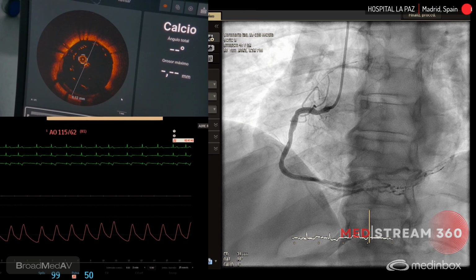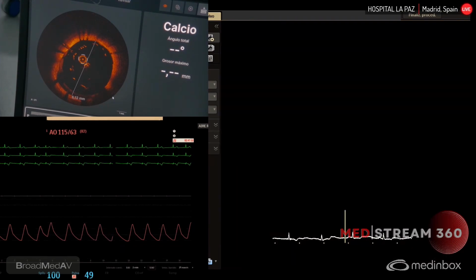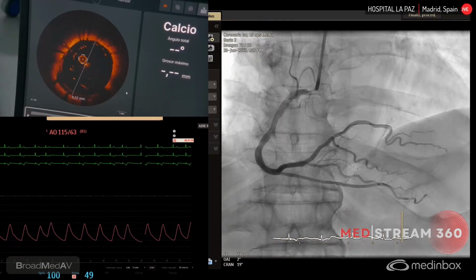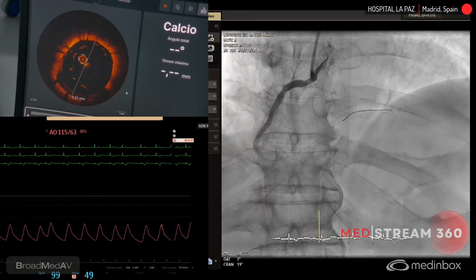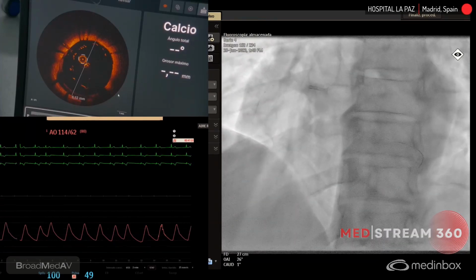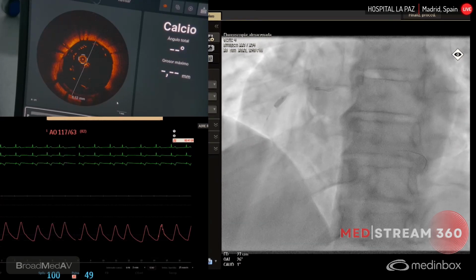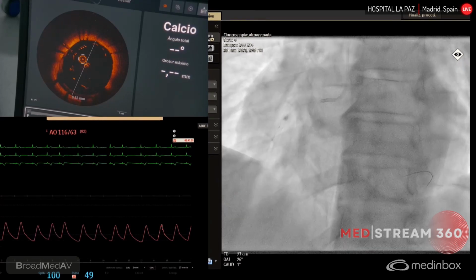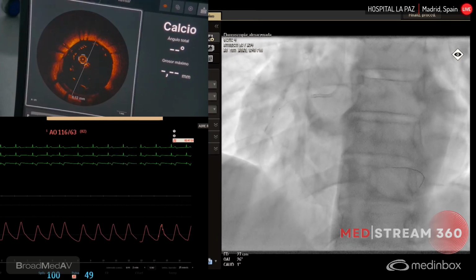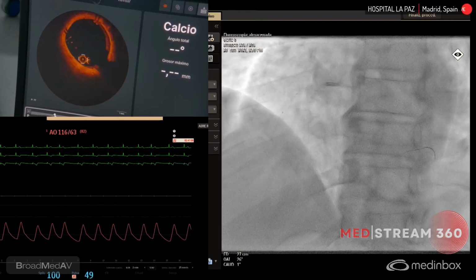Yeah, a 4.5 balloon just to appose this proximal part, because this mid part of 6.5 millimeters in diameter is impossible to appose. So we have post-dilated with 4.5. We had a little bit of problems entering with the 4.5, so we used a Conqueror balloon just to dilate a little bit the entrance of the stent, because the strut was in a bad position.